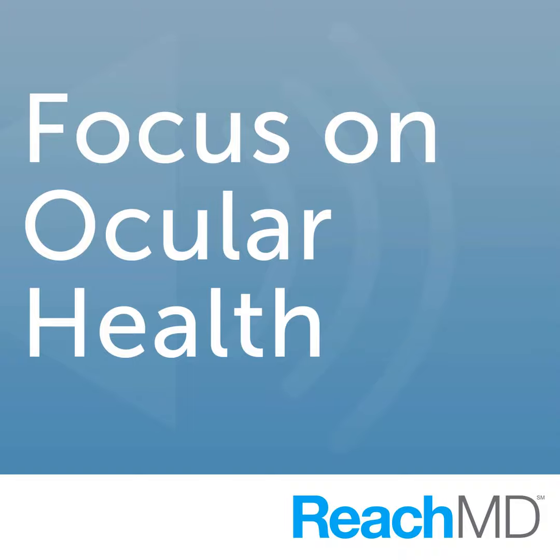Sure. Well, OCT has really revolutionized our ability to examine the retina much like a pathologist would do, but in a living patient, in a fairly comfortable, very quick kind of examination, which is basically the patient sits in front of the instrument and a fairly low-intensity infrared light is used to scan across the retina very rapidly, and it gives us cross-sectional pictures which look very much like microscope slides of the retina. This technology was introduced originally at about 1990 and has continually progressed in terms of the quality of the image and the kind of information that we can see.